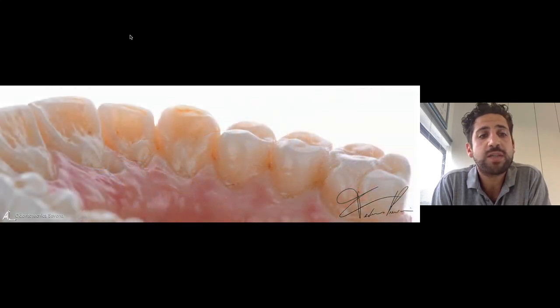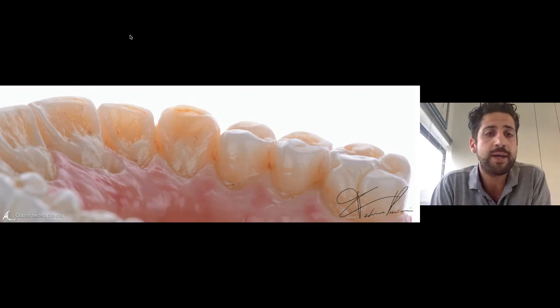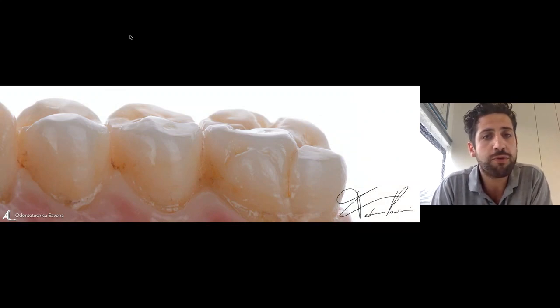Also in this case, we paid a lot of attention to polishing by hand all the surface of the zirconia, because in the lower jaw we had a real antagonist. So we polished by hand all the contacts. Characterization: you can see all the abrasion made smooth by rubber.